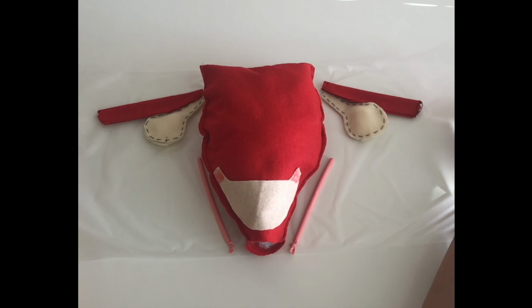Now that you have all the organ shapes, take a sheet of press and seal food wrap with the sticky side up. This will represent the overlying peritoneum. Place the organs on top of the sheet.